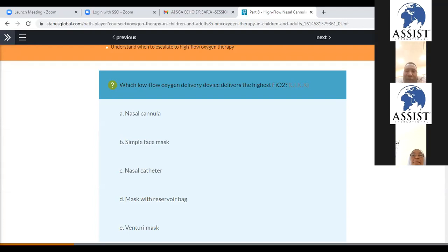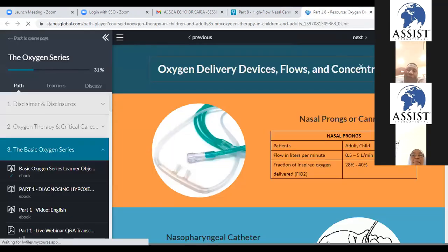I'm still waiting for your responses. Is it a nasal cannula? Is it a simple mask? Is it a nasal catheter? Is it a mask with a reservoir bag, or a Venturi mask? So since there's no response, maybe Kevin, you can just click here and see which one will deliver.